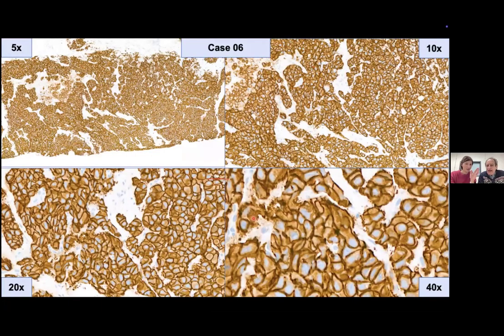Now, they want to cut us off, but I want to do a few more cases. Okay. We can skip over this one.